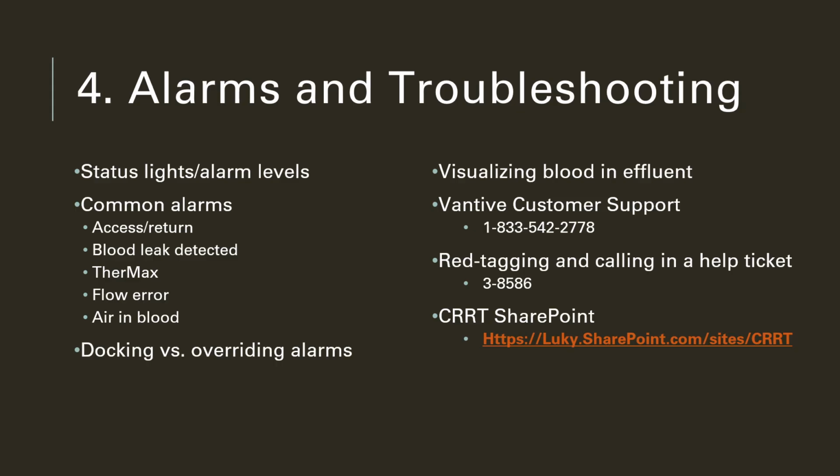The docking versus overriding alarms. Overriding an alarm essentially tells the machine to continue doing what it's doing, that the user has acknowledged the alarm, versus docking just simply moves the alarm to the dock, allowing the user to change settings while the alarm is still present.